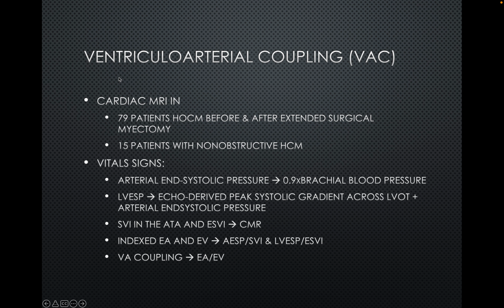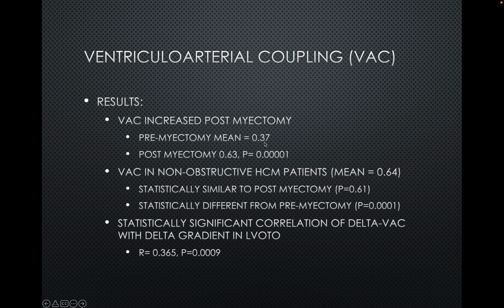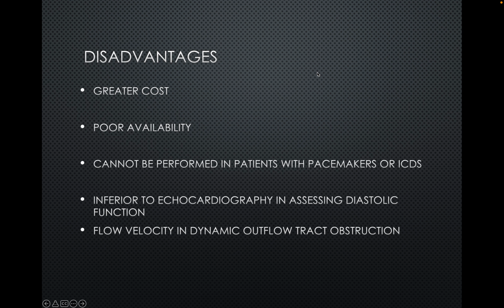We are running a study about ventricular arterial coupling, using MRI to non-invasively measure it pre and post myectomy, to see the changes not only in the ejection fraction but in the ventricular arterial coupling.